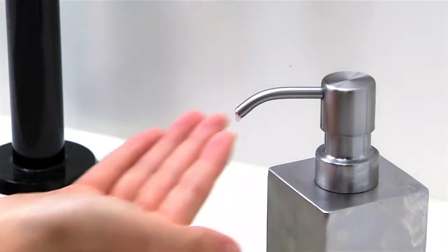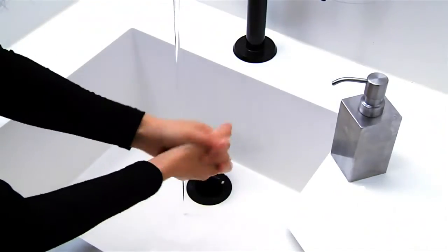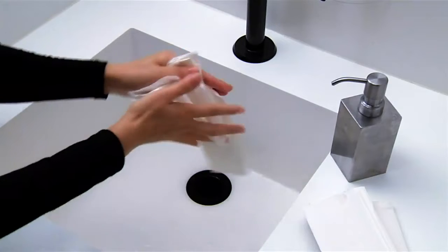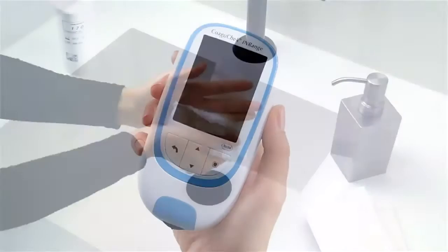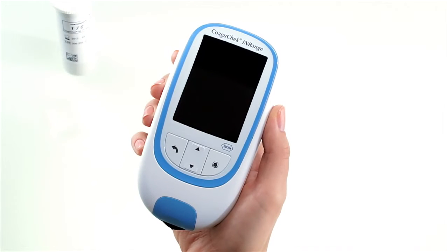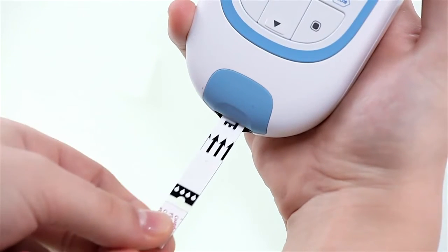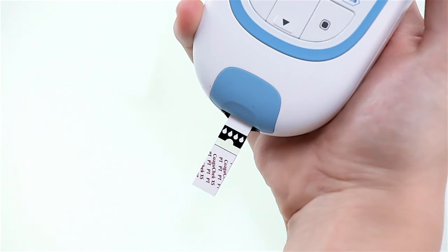To get a suitable drop of blood, remember to always wash your hands with warm water and dry them thoroughly before you test your INR value. Place the meter on a level, vibration-free surface, or hold it in your hand so that it is horizontal, like on a desk or table. Power the meter on by pressing the enter button, or you can insert a test strip into the meter, which will turn the COAGUCHECK INRANGE meter on and put it into test mode directly.